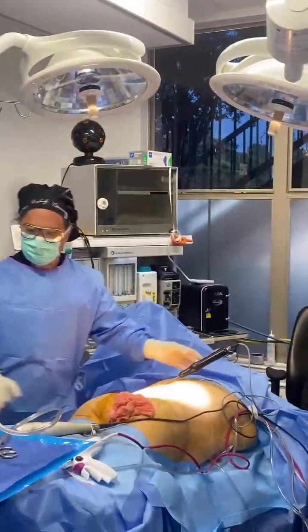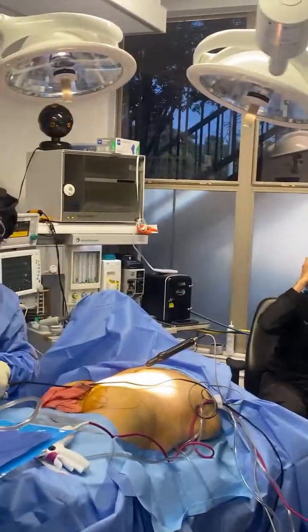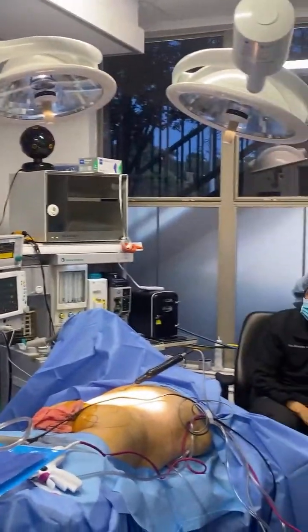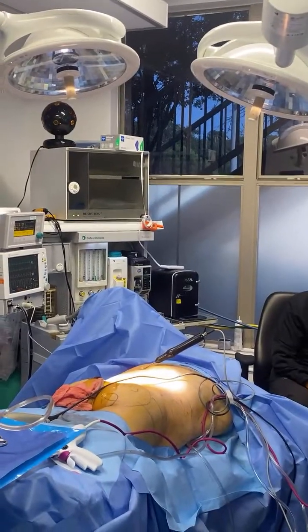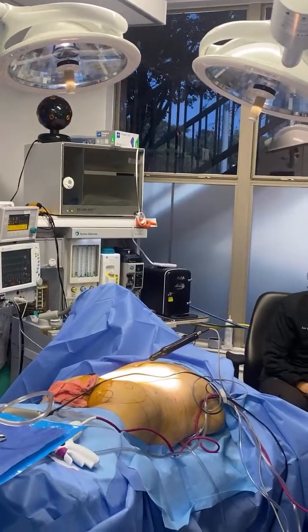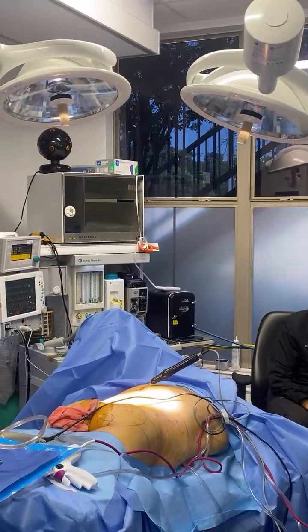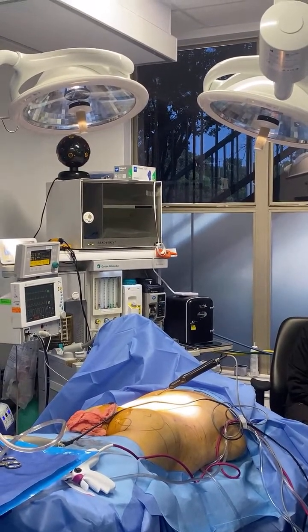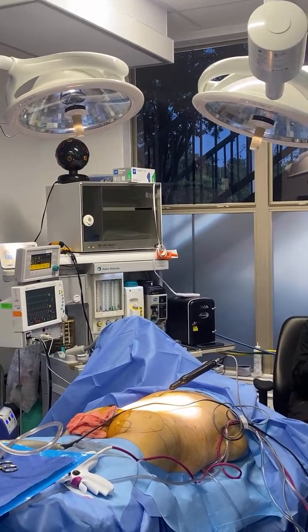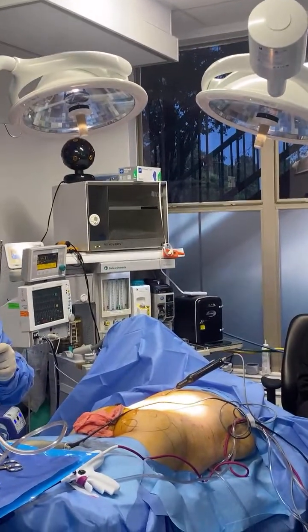Thank you. I just need the actual adapter. This thing went through like this when I lifted it up, went through here. So I left it over there, but you gave me the adapter. It's not the... I need this adapter. Yeah, it's in there. You might want to use that cannula that's in there because it's longer than that one. Unless you want the shorter one. This is too thin for me. You're funny as hell, man. I already got the 4mm here in my pen. Where's the 6? The 6s are going to be this long, bro, because they said 15 centimeters.